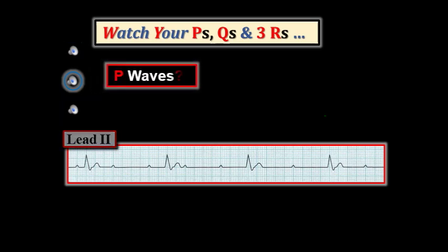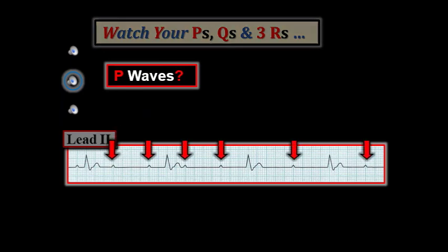There is regular atrial activity in this tracing, red arrows. Even though we can't quite see atrial activity as well as we would like in all parts of the tracing, the overall regularity of the P waves we do see, plus the suggestion of notching within the ST segments highlighted by the white arrows, suggests that the atrial rhythm is indeed regular throughout.